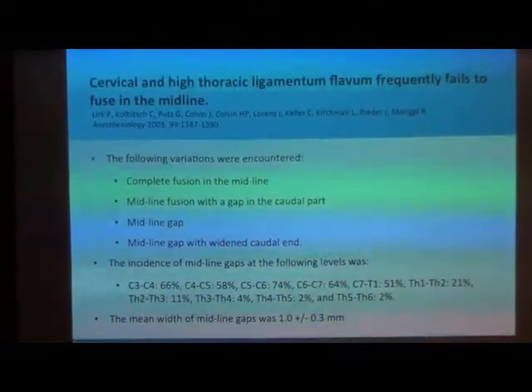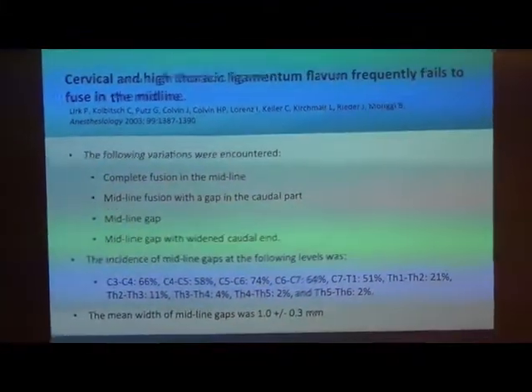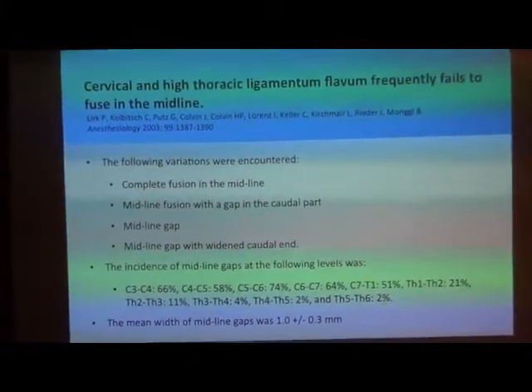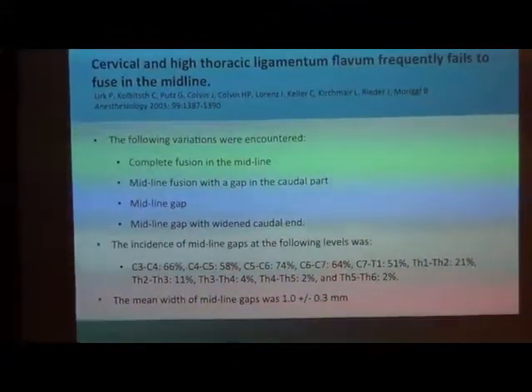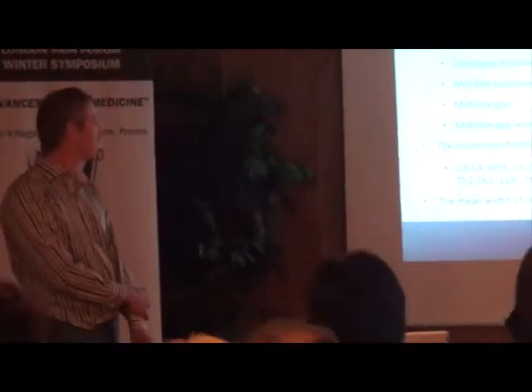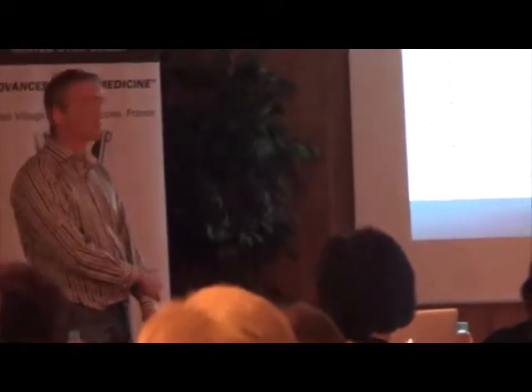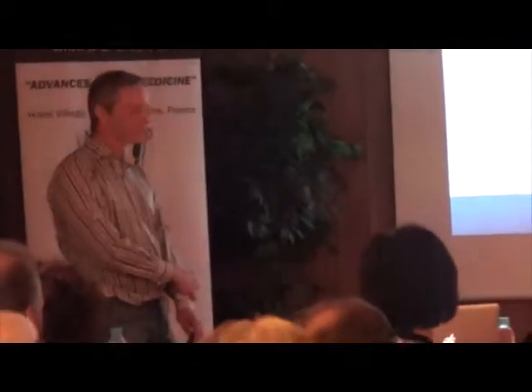Okay, this is a study of Flick, and everyone refers to this study. It actually shows that in more than 50% of the cases the ligamentum flavum is not fused in the midline. And there is a risk of going into the epidural space without feeling loss of resistance. But how significant is it? It was the only study. It was a low sample study, only 50 cadavers. And if you see the mean width of the gap, it's 1 millimeter. So what do they consider a gap? Sometimes it probably doesn't exist, sometimes it's big.